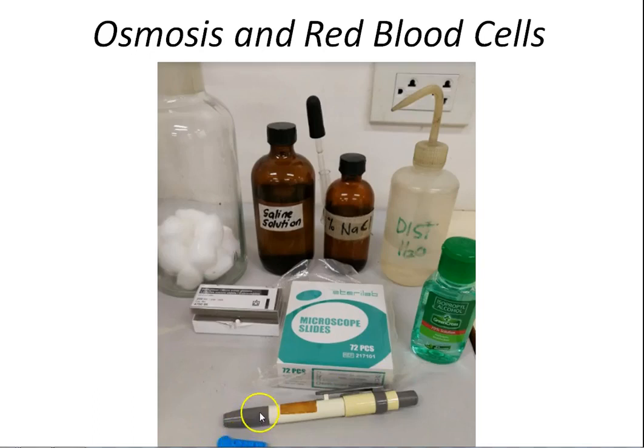We place this inside the pen, and then we can calibrate this so that we will have a certain length coming out of our pen, so that our subject will not have any unnecessary harm.